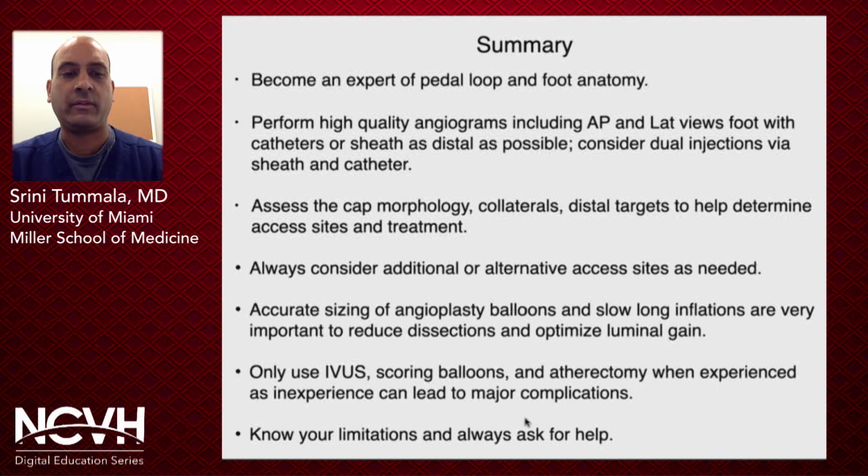Pedal access, whether it's antegrade or retrograde, is oftentimes needed with these types of interventions below the ankle. Remember accurate sizing of your angioplasty balloons. You will lose about 1/3 of your mean luminal diameter within 15 minutes. So you want to do slow, long inflations to get to the optimal size, which hopefully you've used IVUS or extravascular ultrasound to determine. And the prolonged inflation of 2 to 4 minutes can really help reduce dissections and optimize luminal gain.